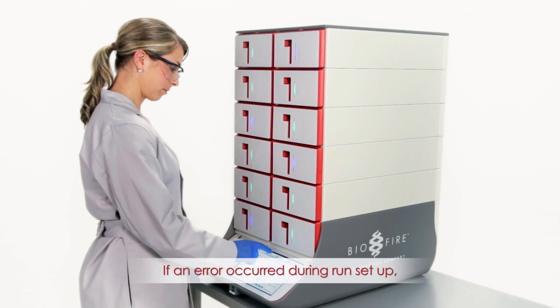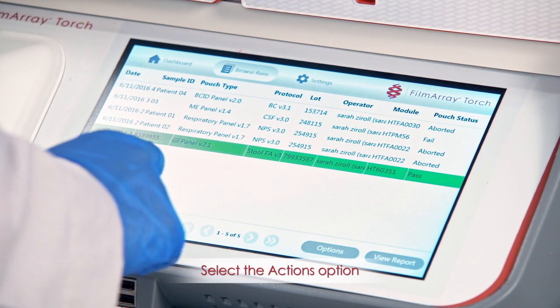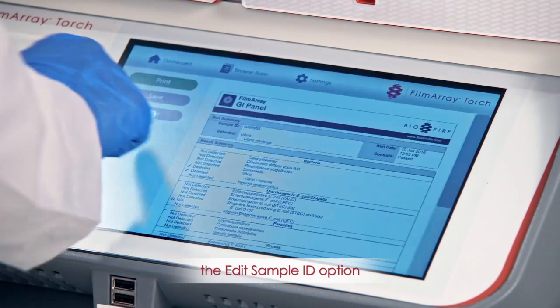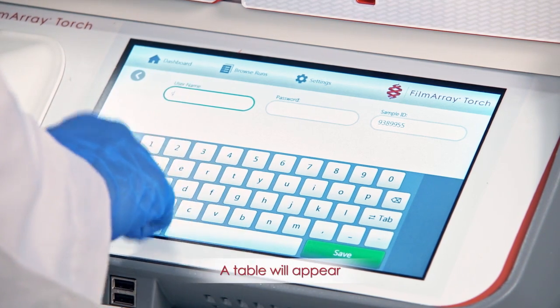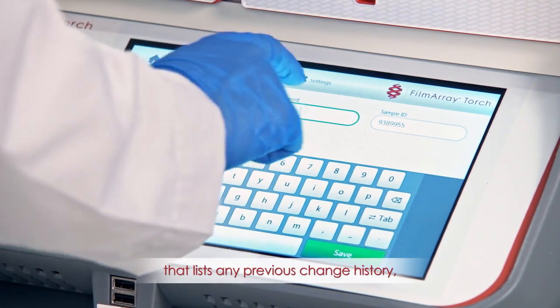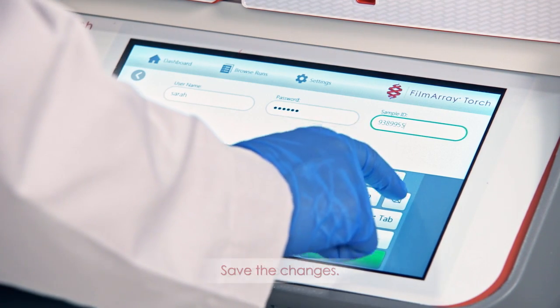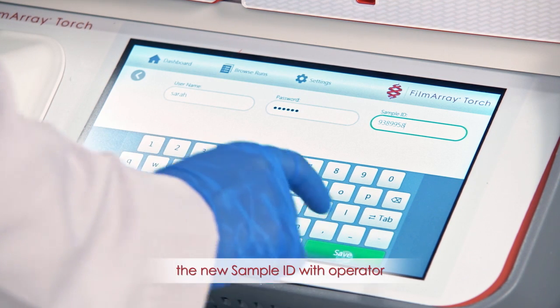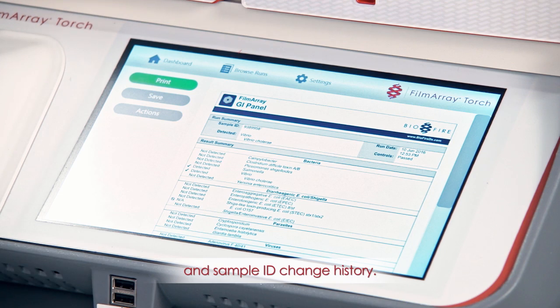Edit Sample ID. If an error occurred during run setup, the sample ID can be changed. Select the Actions option in the View Report page, and then select the Edit Sample ID option from the menu. A table will appear that lists any previous change history, and an update to the sample ID can be made. Save the changes. The report will now reflect the new sample ID with operator and sample ID change history.